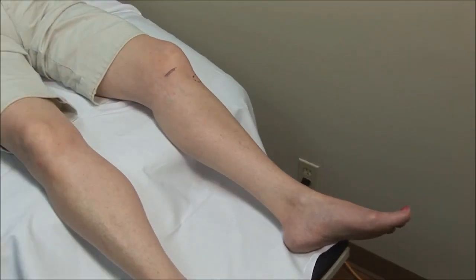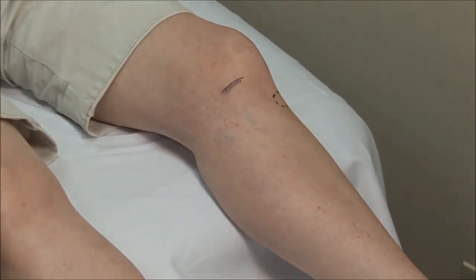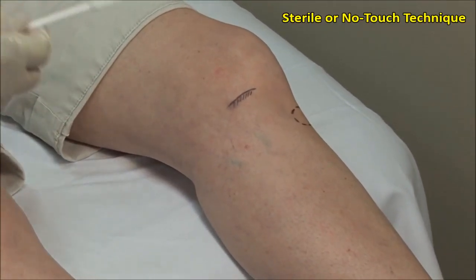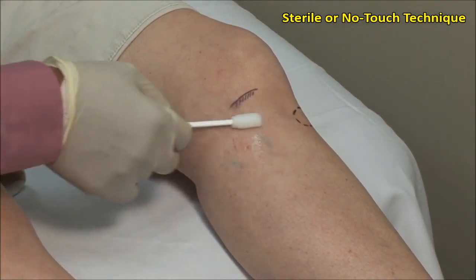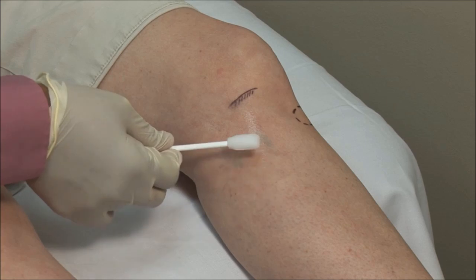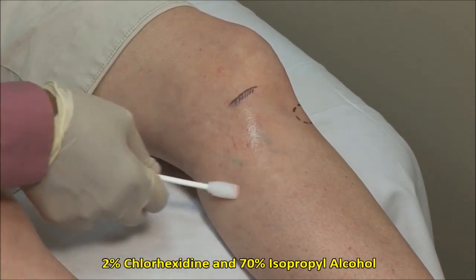Injections of the Anserine bursa are done with the knee slightly flexed and the leg externally rotated a little. These injections should always be done using sterile technique. Scrub the site and then clean in an outward fashion. I am using a mixture of 2% chlorhexidine and 70% isopropyl alcohol.